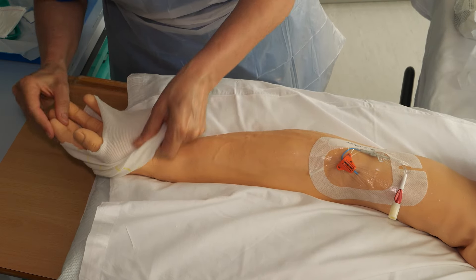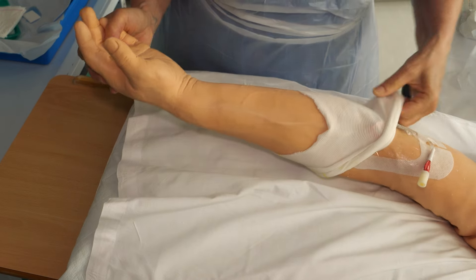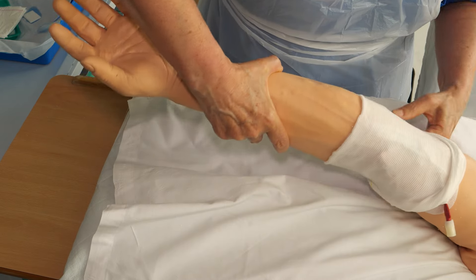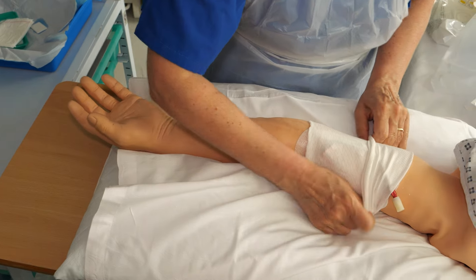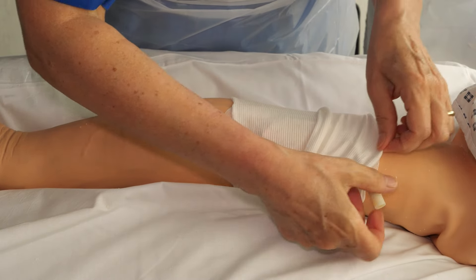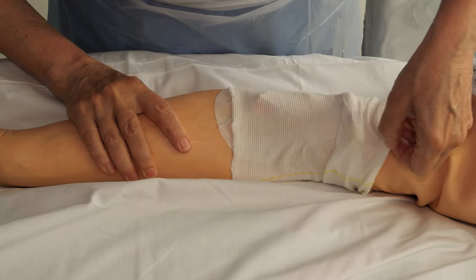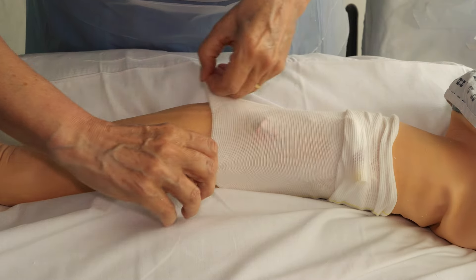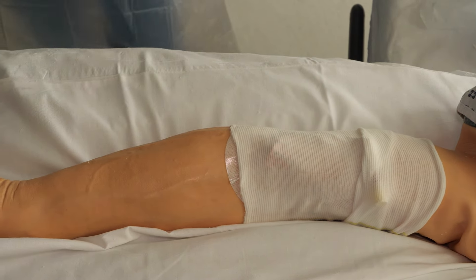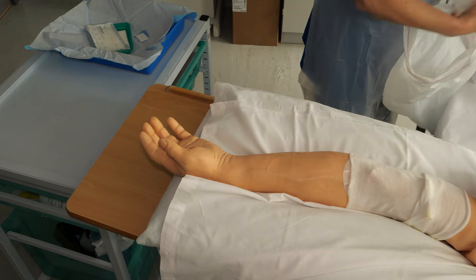Cover the PICC line with Tubi Fast or a purchased fabric cover, ensuring that the line is secured under the cover. Your PICC line dressing and flush is now complete. Use the bag to dispose of the used items — this can be placed in your domestic bin.